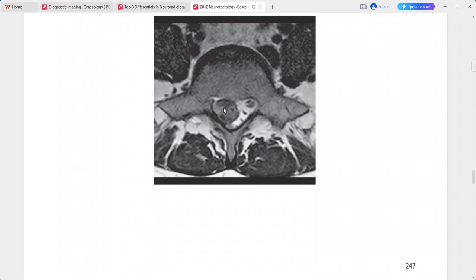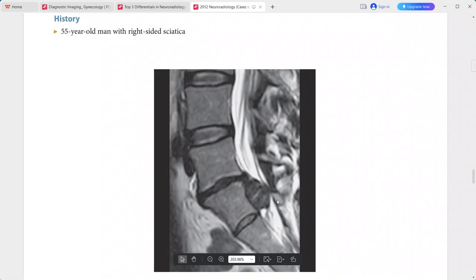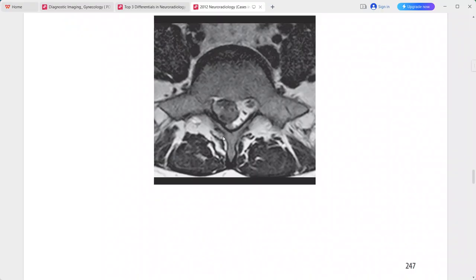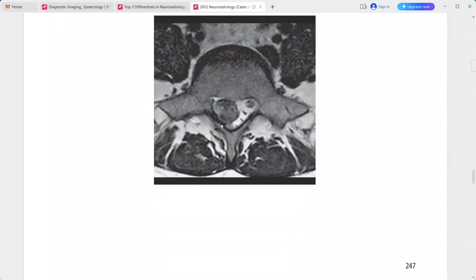The mass is continuous with the L5-S1 intervertebral disc. It is deforming the thecal sac and displacing the right-sided sacral nerve roots. This is a case of disc extrusion. In the differentials, you can include sequestered disc, disc protrusion, and nerve sheath tumor.